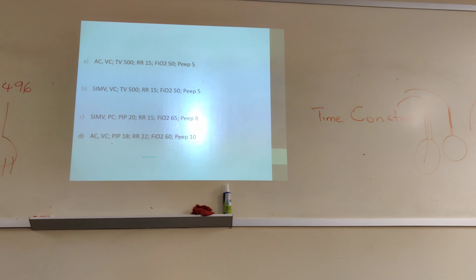And on the exam, either one of them will be right. And they will do that to you, so don't worry about that. Like I said again, the mode doesn't ventilate. What ventilates is what you have inside the mode. So if you look at two of them, they have the same thing, so they will maintain that CO2 at the same level. So you pick either one of them, you should get it right. They usually do that on the clinical simulation. They don't do that on the written test. The clinical simulation is where you're going to see that.